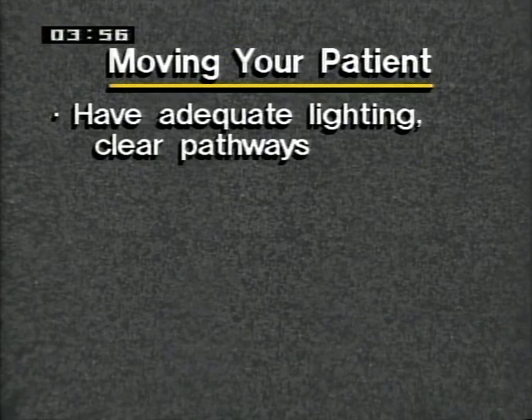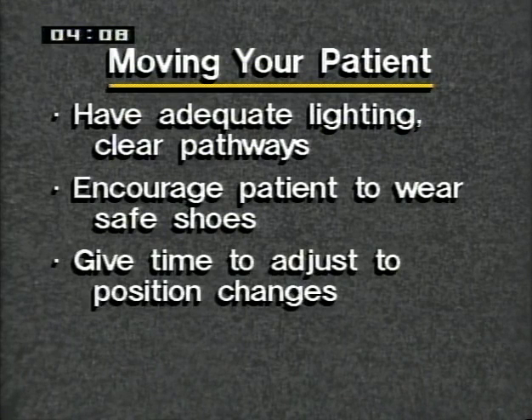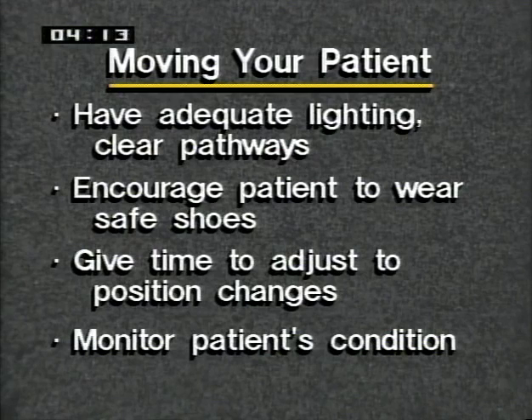Put safety first. Have adequate lighting and clear pathways. Remove any obstacles to ambulation. Encourage the patient to wear sturdy, safe shoes. Give the patient time to adjust to a change in position. Monitor his or her condition as they transfer or move.